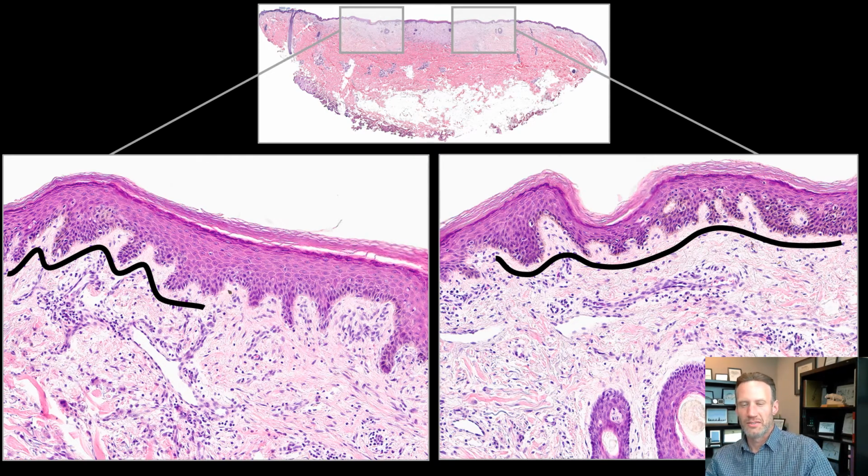But whether these melanocytes should be interpreted as an extension of the neoplasm beyond the scar, or whether they simply represent so-called reactive melanocytic hyperplasia, has been a matter of some uncertainty and debate among the many dermatopathologists who have now examined this case. In any event, the pagetoid growth that was so striking in the center of the lesion is clearly not present beyond the scar. It's entirely confined to that area overlying the fibrosis.